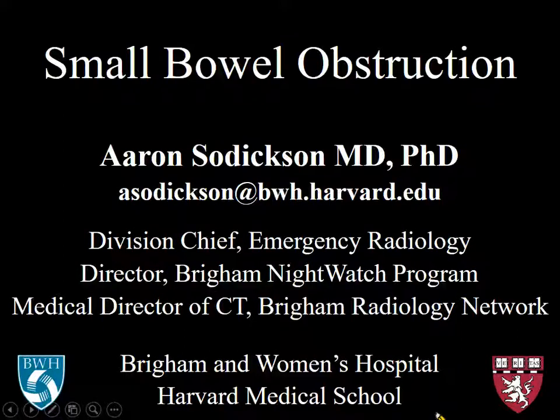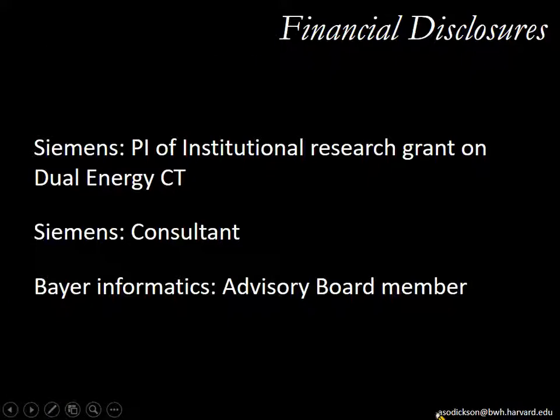Topic of small bowel obstruction. So I've picked a number of cases that I think are instructive and that can help us to analyze these cases logically and make some important distinctions that are helpful for our surgical colleagues.